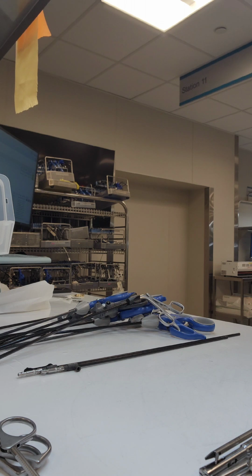But in the process of me looking for those instruments, I probably found 2 more instruments that were damaged. So I wind up taking those out of circulation as well, because I grabbed one and said, ooh, that's probably the one that I need, and that was damaged. I can tell you right now that one of the 2 instruments I took back there, I could not find, so I had to mark that one missing. It's funny, because I think probably a year ago I heard someone speaking and talking about quality, and one of the statements made was that an instrument set with a missing instrument is still a quality instrument set.